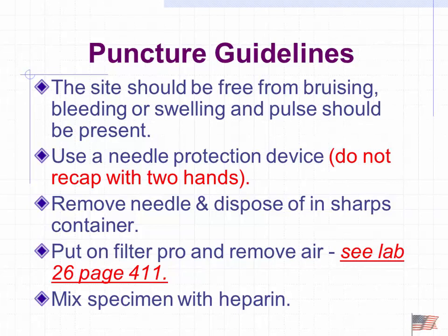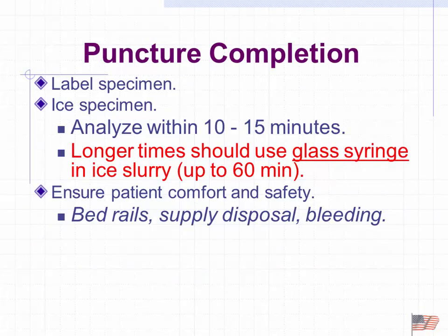We never want to recap with two hands. We're going to use a needle protection device, remove that and put it into a sharps container, remove any air. We'll talk about that in a second. And then we're going to mix the heparin so it's well distributed in the blood by simply rolling the syringe.